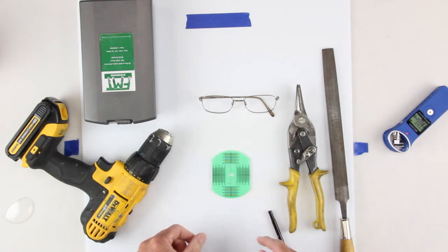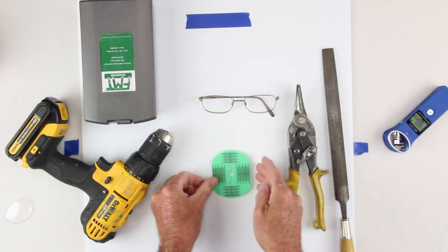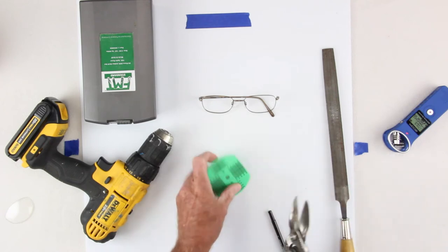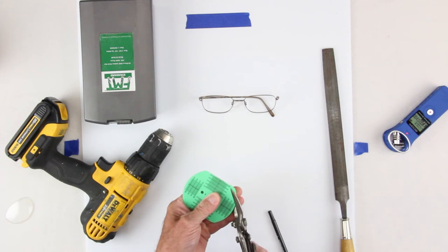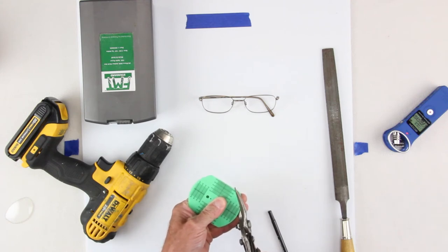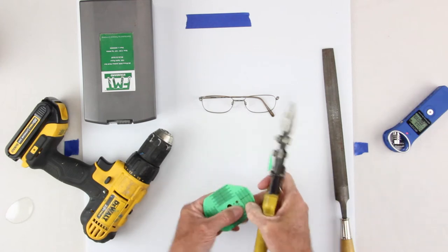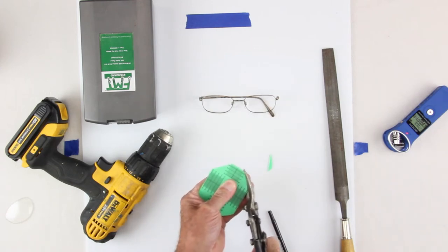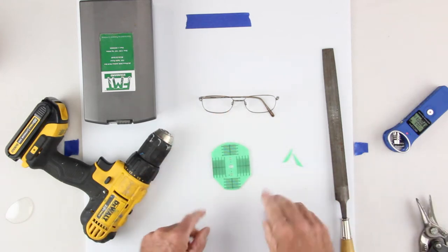So this will be the top of my head, this will be my chin, so I think the first thing I'm going to do is I've got my 35 mark and my 30. I think I'm just going to cut across that, and cut across that. And so that gives me kind of my chin there.